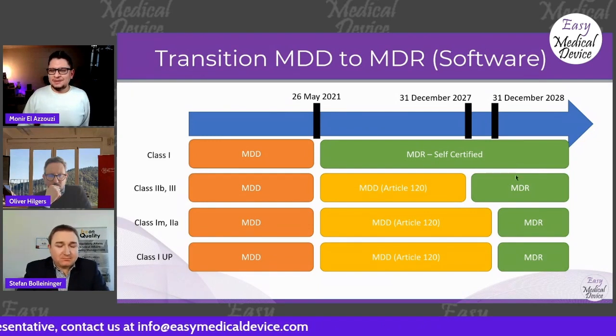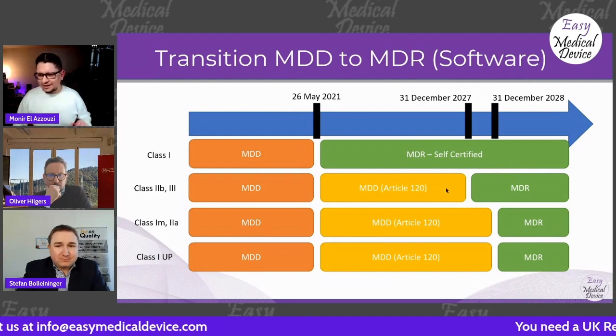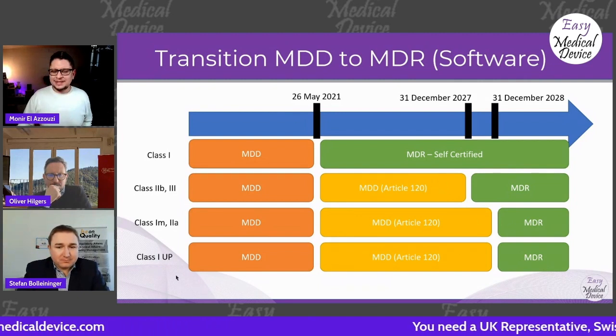So maybe as a last point to discuss: when we say significant change of the software, can we say that a cybersecurity threat, where you are changing your software because there are updates due to changes for security, etc. Can we say that those are significant changes that can also impact this transition period?